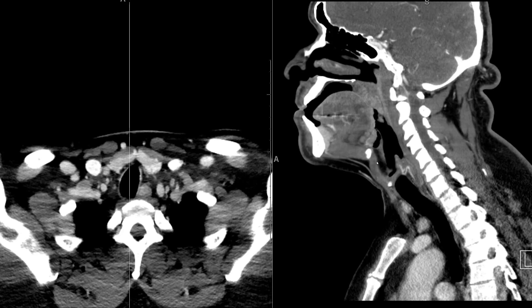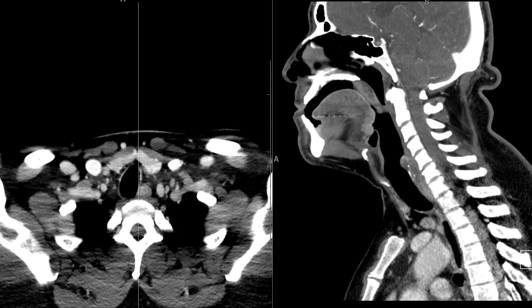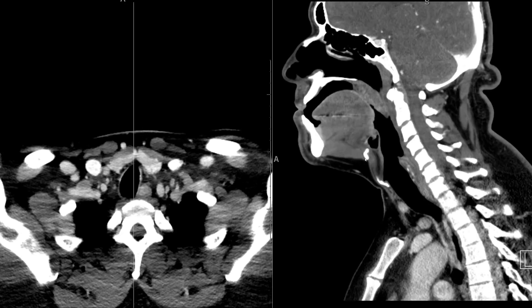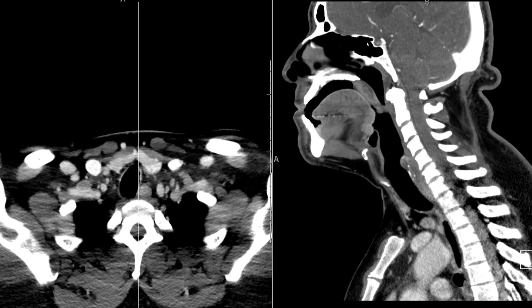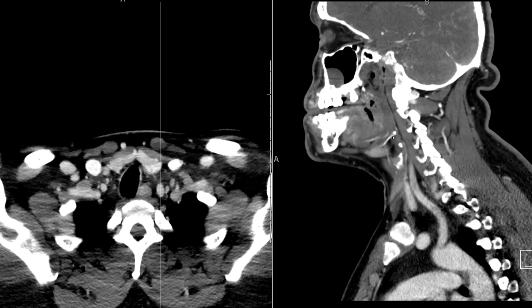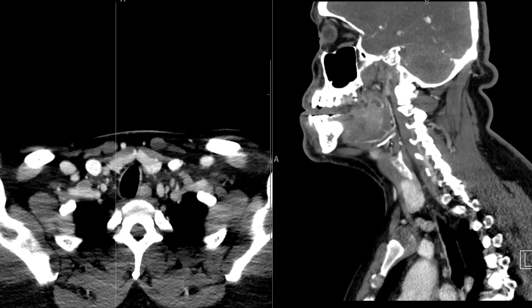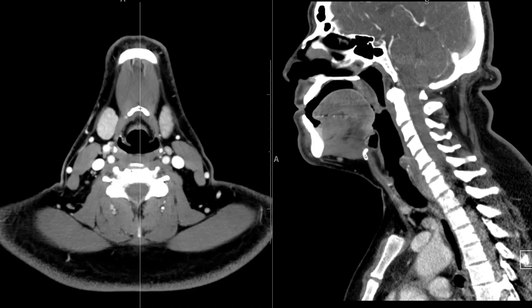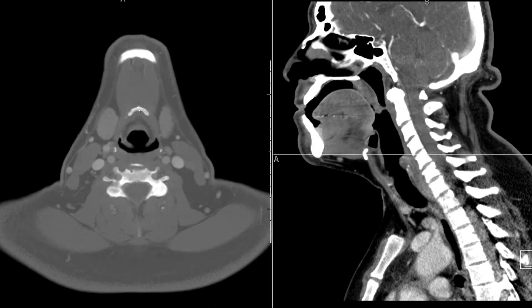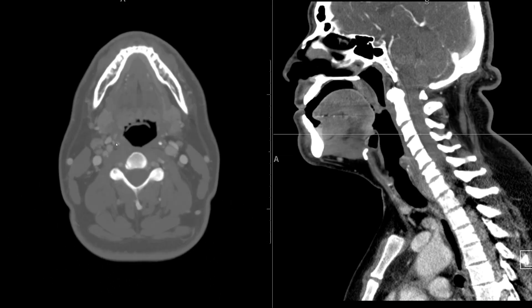There are supporting structures anteriorly — cartilages and bones — and on the sagittal view we can lay them out. We have the hyoid bone up top, which is where all the muscles with 'hyoid' in their name attach, such as the geniohyoid and mylohyoid, coming from anteriorly and superiorly to form the inferior border of the floor of the mouth. On the axial view, you can see the hyoid bone extending back here.